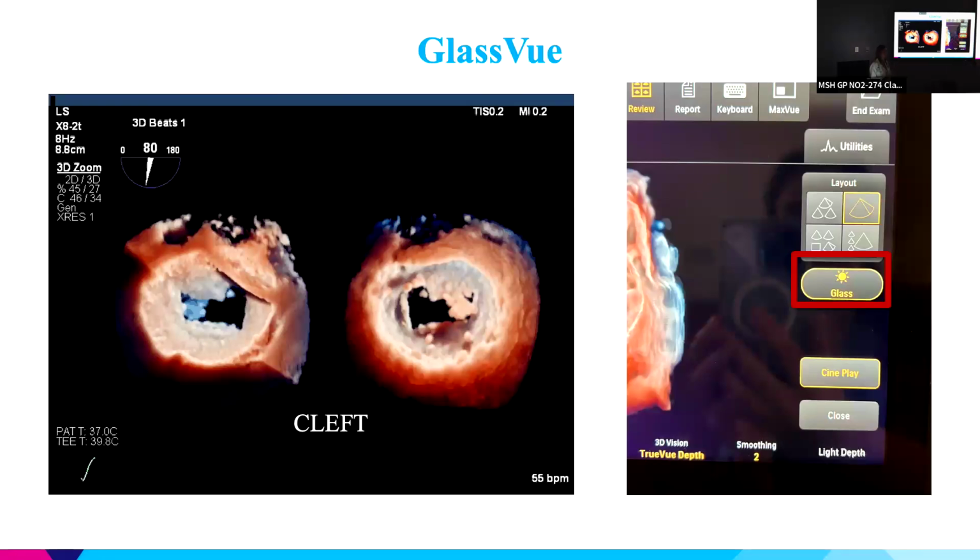It could be a fold, especially in very myxomatous valves. You know, if they fold, it could look like a cleft. So you want to see it open, you want to see it from both sides if you can, and you want to make sure that it goes down to the annulus, especially from the bottom side. That's how you know the difference between a fold and a cleft.